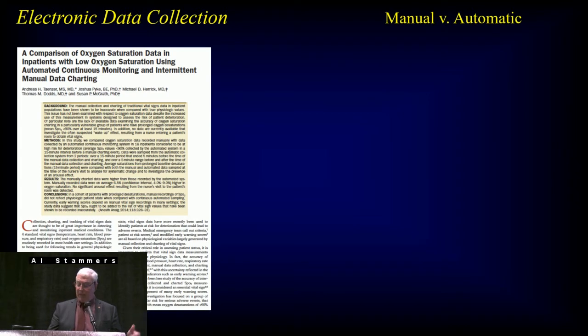This is by Tanzer and Associates, and they just looked at oxygen saturation in individuals in the ICU. Basically putting on a pulse ox is so critical. In fact, if you look back in the history of medical malpractice, prior to the standardization and the absolute determination that pulse oxes should be put on just about every patient in a hospital, a 1A recommendation, the amount of legal claims against institutions was extremely high. Once pulse oxes were used, they dropped tremendously.